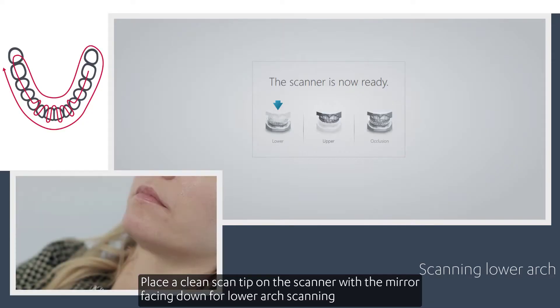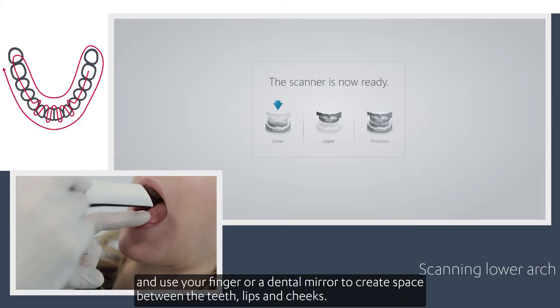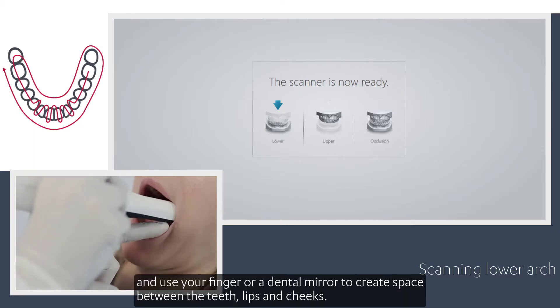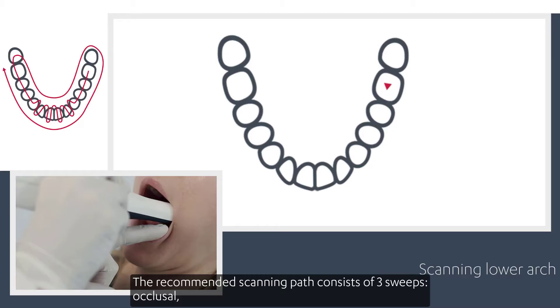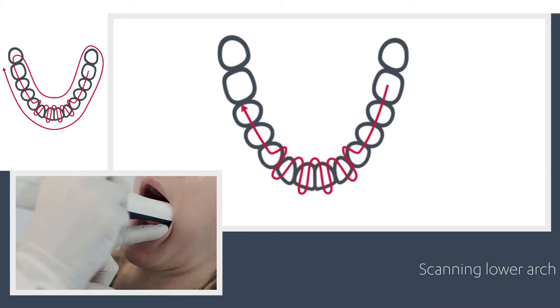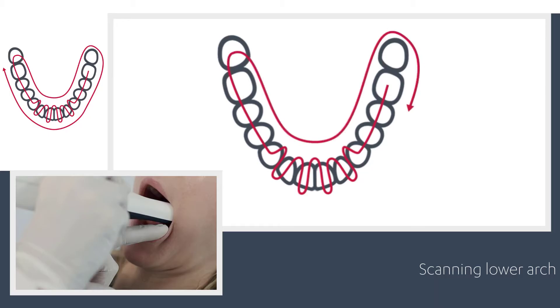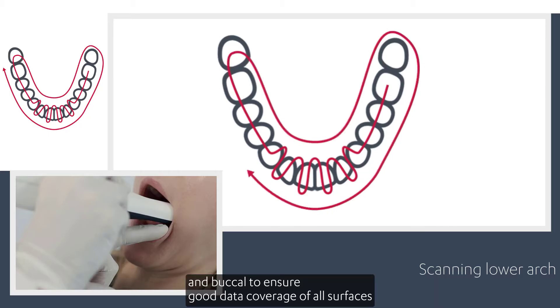Place a clean scan tip on the scanner with the mirror facing down for lower arch scanning, and use your finger or a dental mirror to create space between the teeth, lips and cheeks. The recommended scanning path consists of three sweeps — occlusal, lingual and buccal — to ensure good data coverage of all surfaces.